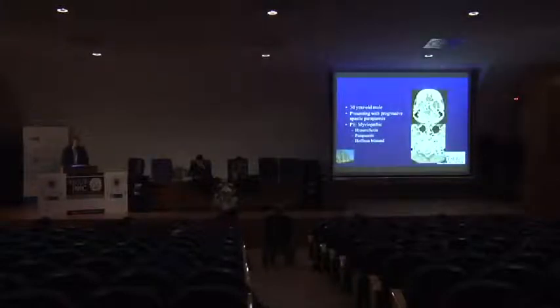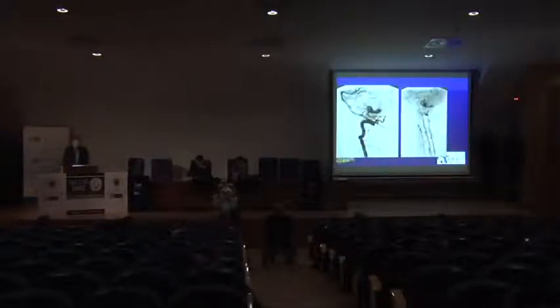There's another case that seems very complex. This young guy presents to us with progressive paraparesis, quadriparesis, myelopathic, and you see here why. All this dilated venous complex from the drainage pattern and increased venous pressure in his system. And you see here a fistula from these very tortuous branches of the vertebral artery. We did embolize and were able to disconnect some of the artery, but we could not penetrate enough to disconnect the vein.